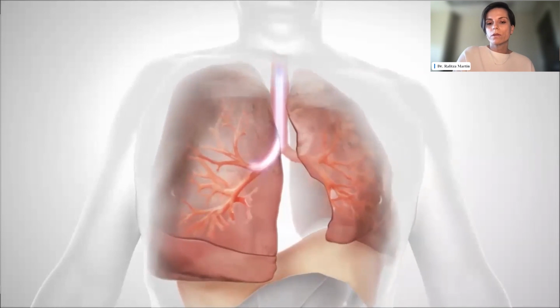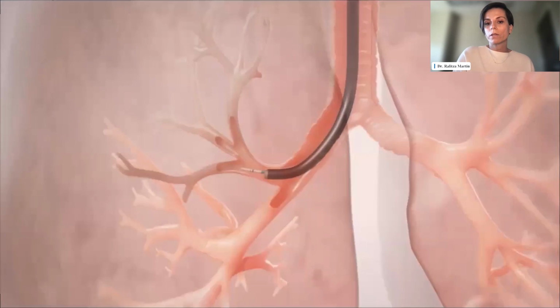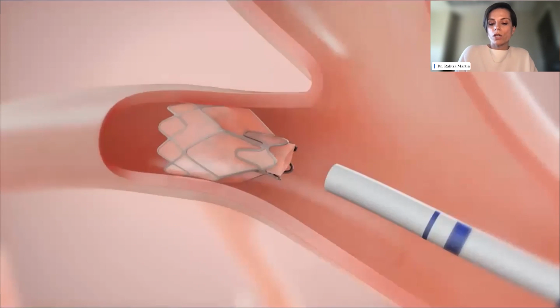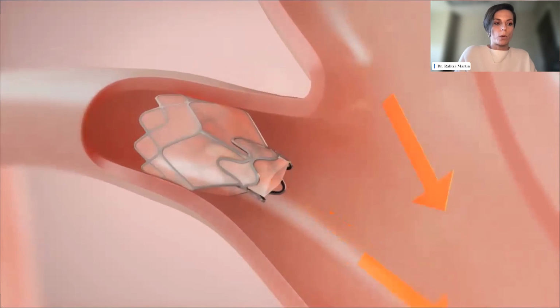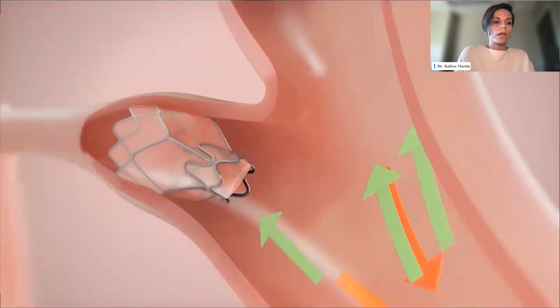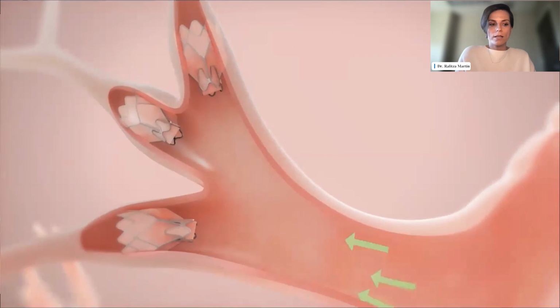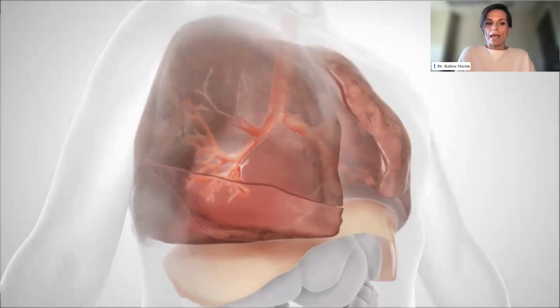They're one-way valves, which we can insert bronchoscopically into a target area of the lung. And by deploying them, one way to describe how they achieve the results is that they improve the mechanics of breathing. By inserting the valves in the target area of the lung, we are able to release trapped air. And with that reduction of hyperinflation, we are able to get better diaphragm and chest wall mechanics.